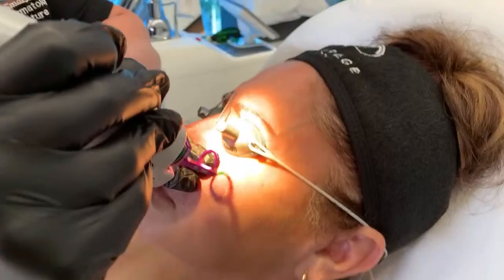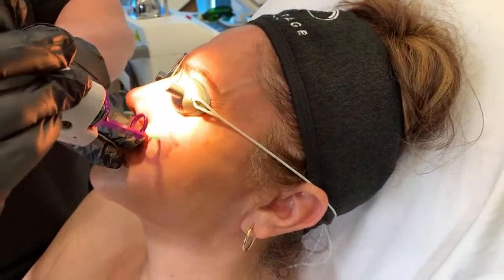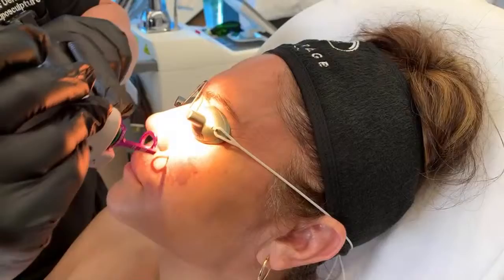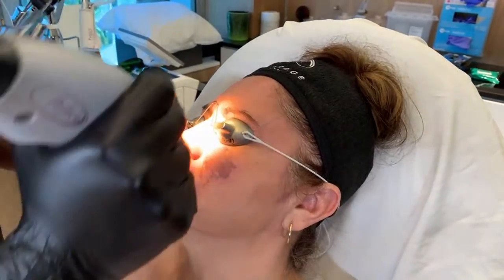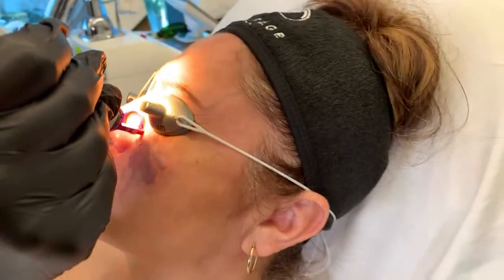Her healing time will be about a week of having a kind of purple-black color. Then I usually want to do the second treatment at about three weeks. The second and third are spaced three to four weeks apart, and beyond that we go to about four to six weeks. I'm just fine-tuning now — you want to give these a few seconds to respond.